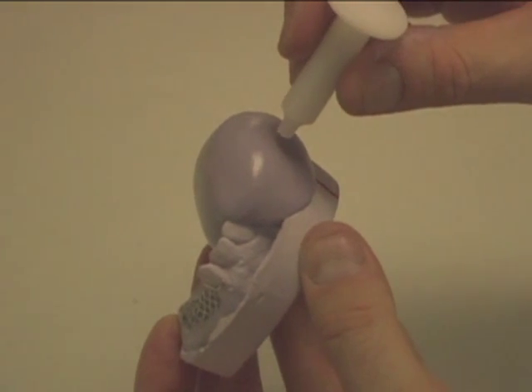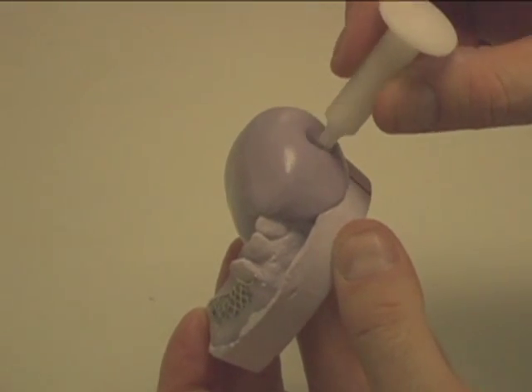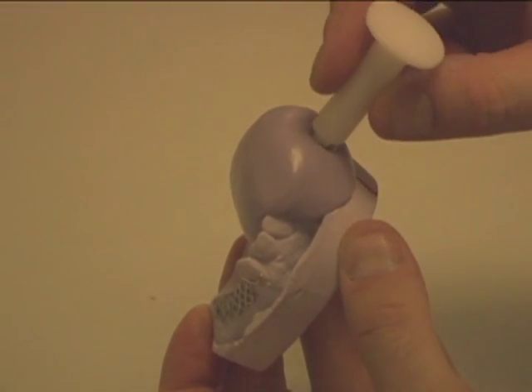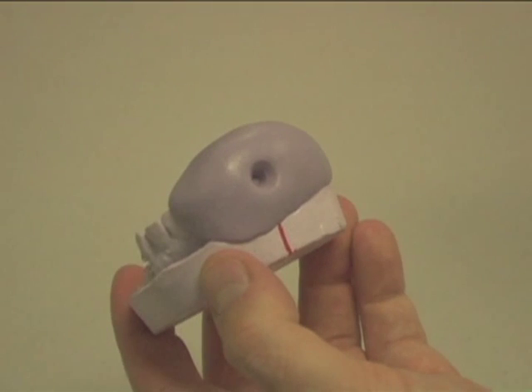Then estimate where the tip of the clasp is and indent down onto the base of the putty tool. Repeat mixing of the putty if creating two clasps. Make sure that the first putty matrix is fully set so as not to move or warp it.